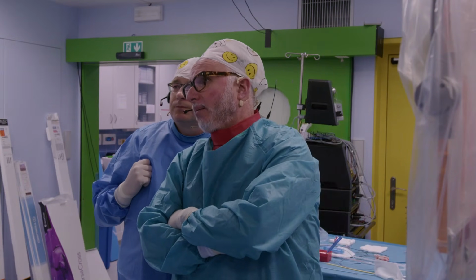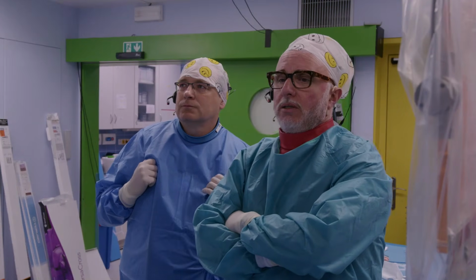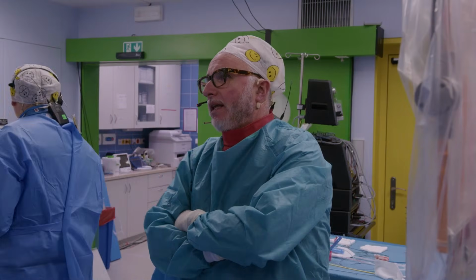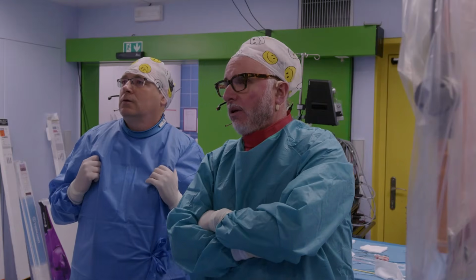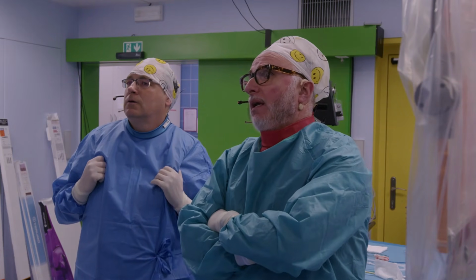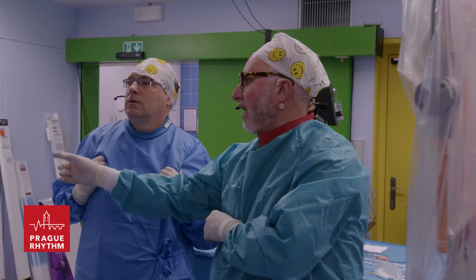So we did the ablation as we showed you, and as Dr. Shilo recommended, something in the endo needed to be done. But actually, the PVCs came back mostly with a narrow configuration, not the wide configuration. So we went just with Thermacool again to the opposite side. I think I saved an image.